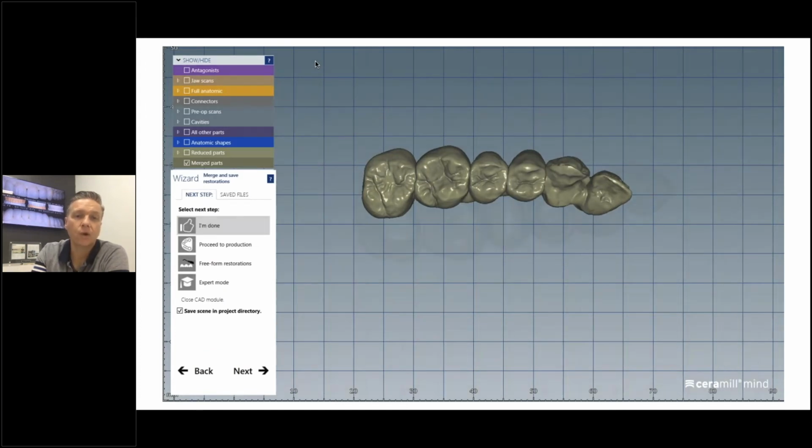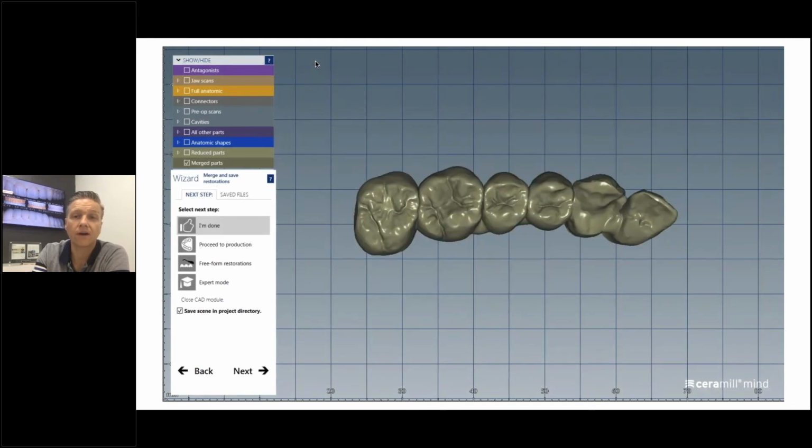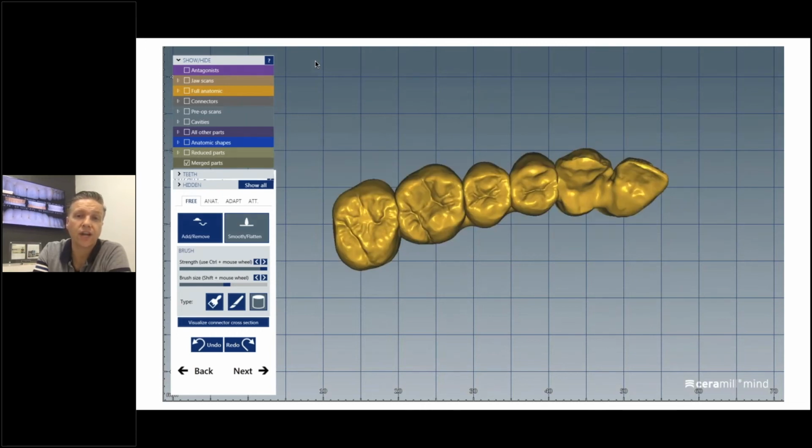But you can also tell my connector strength here in the posterior and the pontics. It's pretty rigid. So I definitely have to make sure I have enough strong connecting area where the bridge pontics are, especially mesial and distal of it. That's usually the area where it breaks. From here, I can go back to my freeform mode and smooth out these connectors a little bit, so they're not too humpy, make them a little more organic shaped, and finish up the design.